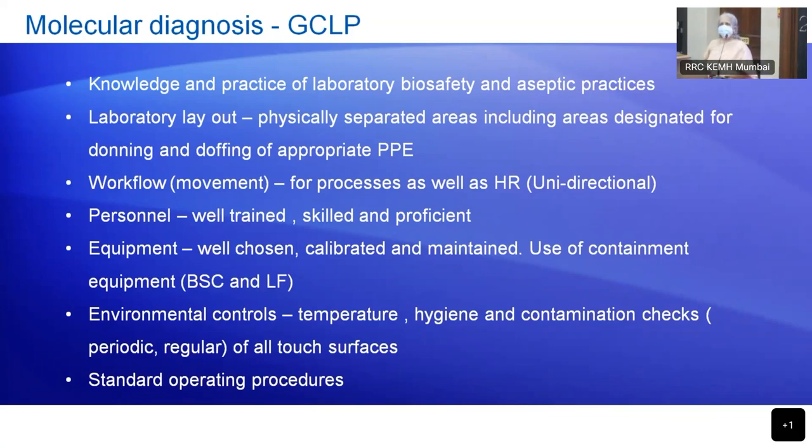Then the laboratory layout. We saw those many processes, 1, 2, 3, 4, 5, 6, from sample acceptance to detection. All those processes should ideally happen in separate, physically separated areas. If you cannot have so many separate areas, there should at least be three areas, or even this in the next slide. And then the workflow.